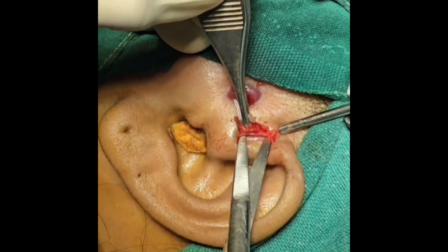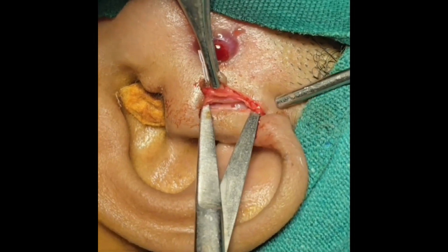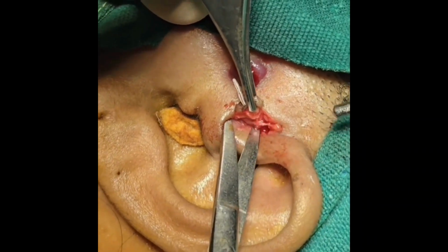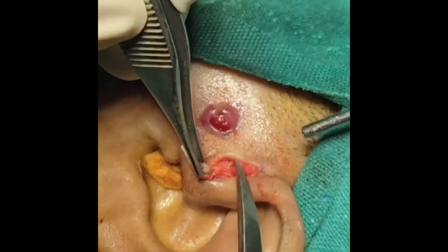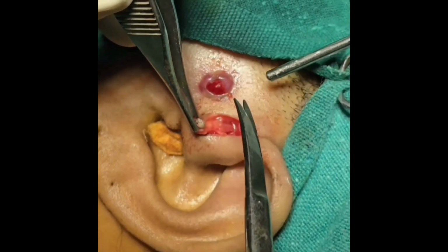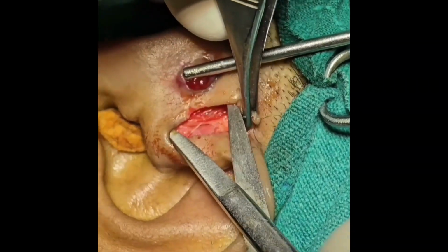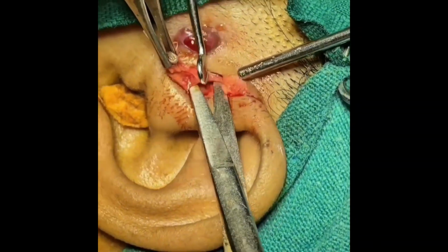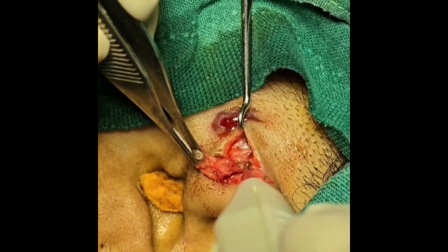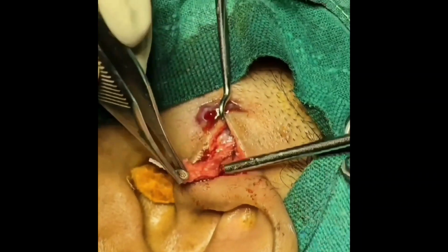So after that, we're using the sharp scissors. I'm doing a dissection, identifying the tract here. The main cue, the main hint for a proper dissection and prevention of recurrence is that most of these tracts are adherent to the helix. So one has to find a plane between the perichondrium of the helix and whatever between that and the subcutaneous tissue, whatever soft tissue is there anterior to it. So that is actually the plane of dissection. So you stay flush to the helix, then we will not miss out the tract.